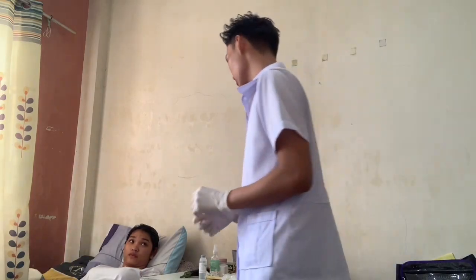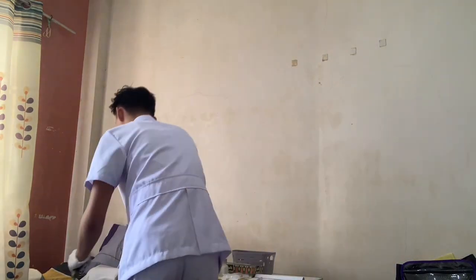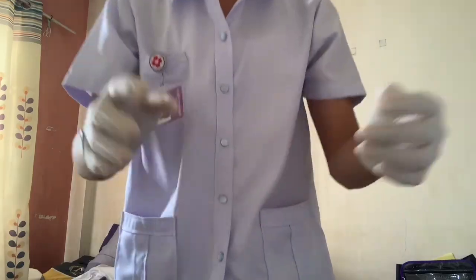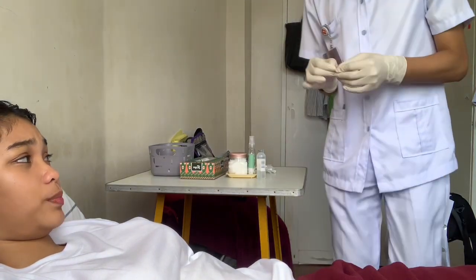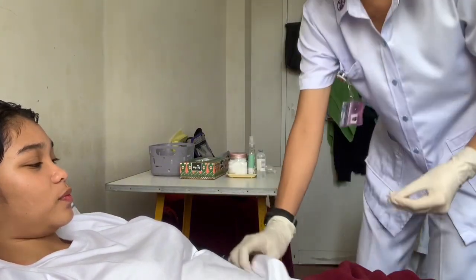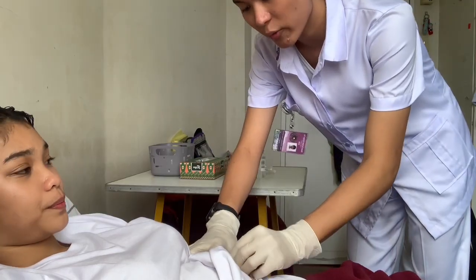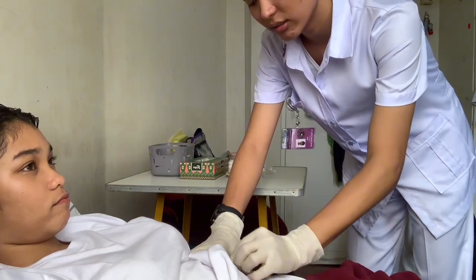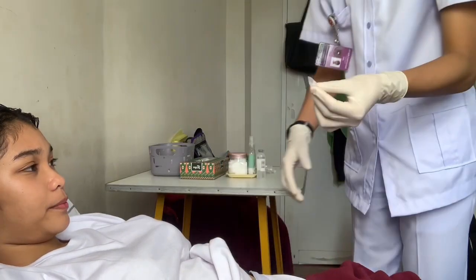After doing that, we are going to clean the site of the hand. So the next step that we will need to do is to clean the site for the injection using an alcohol swab. Now, center going outwards for about 5 centimeters or 2 inches. Then I'm going to dispose the antiseptic swab.